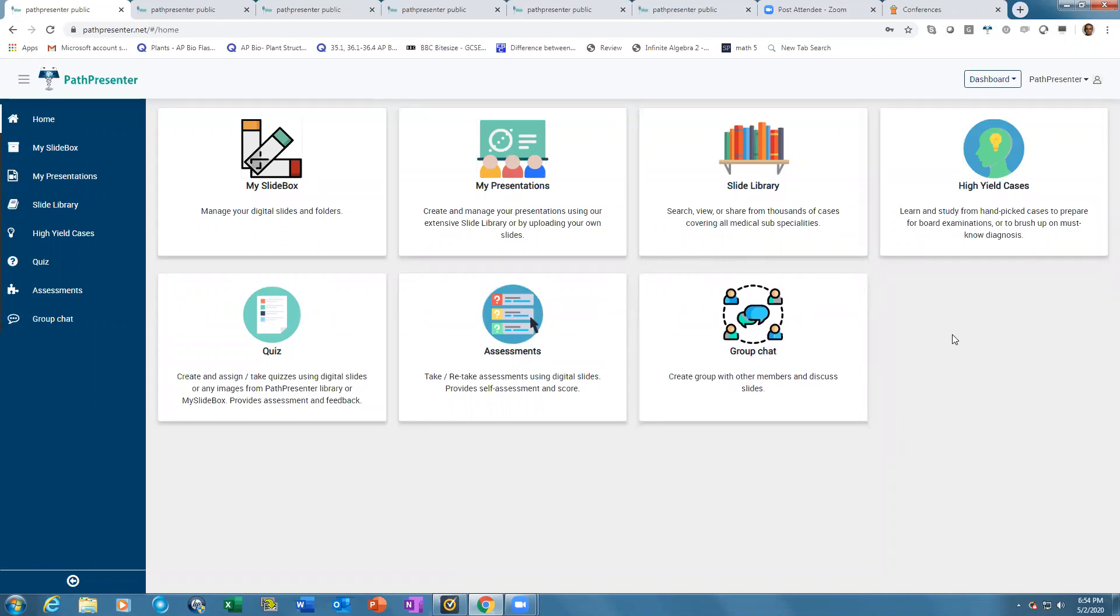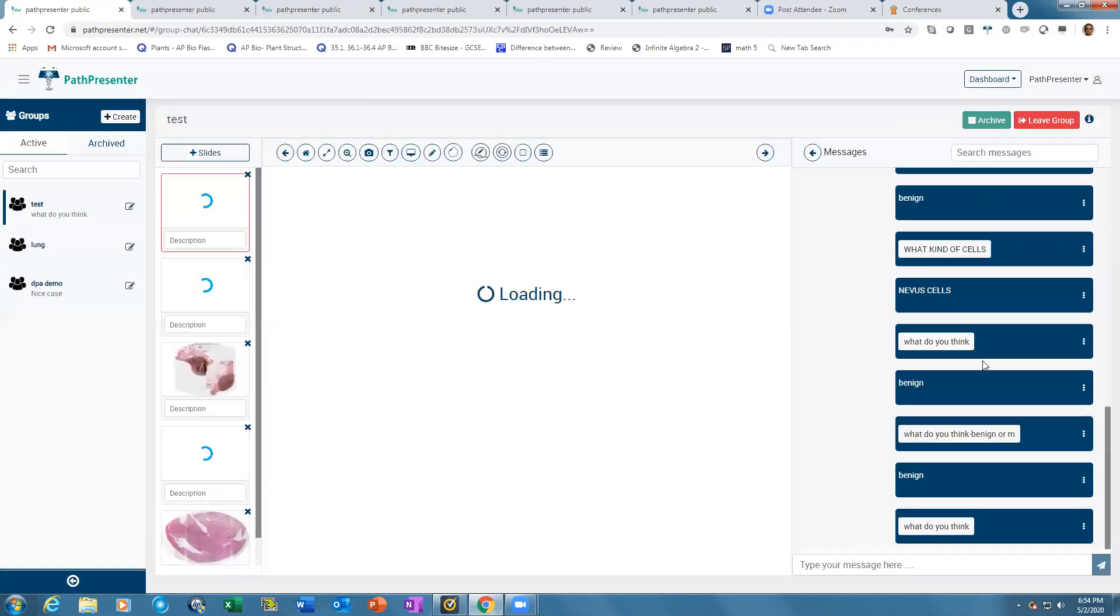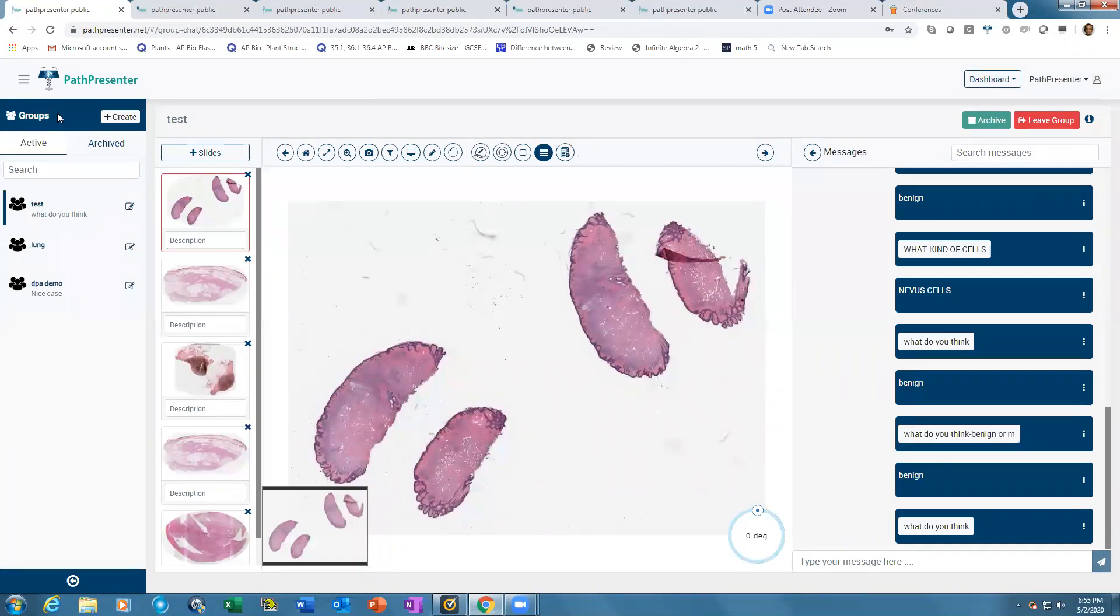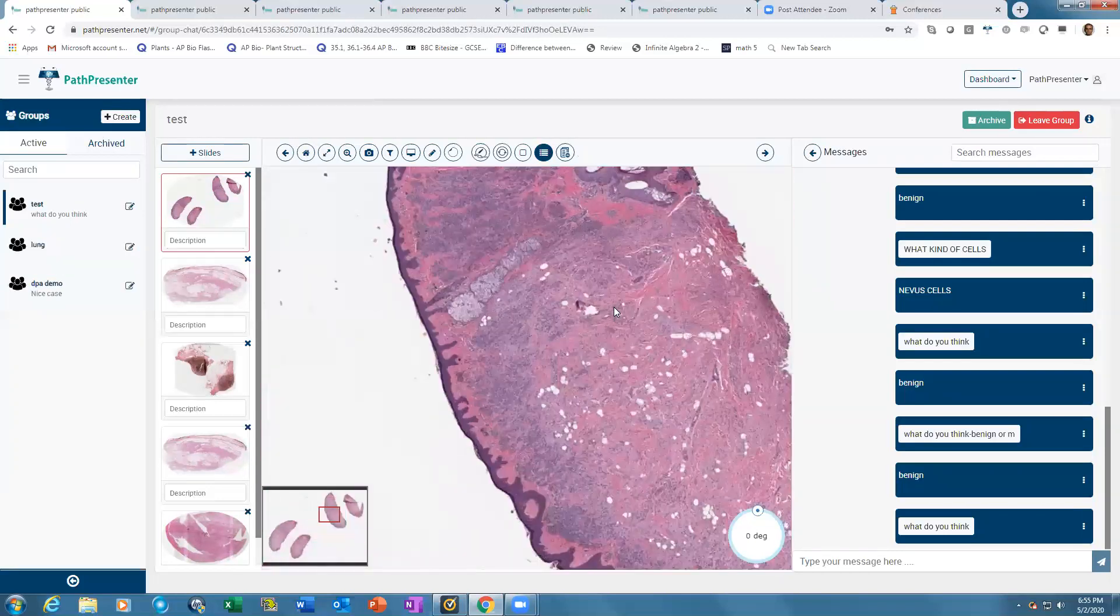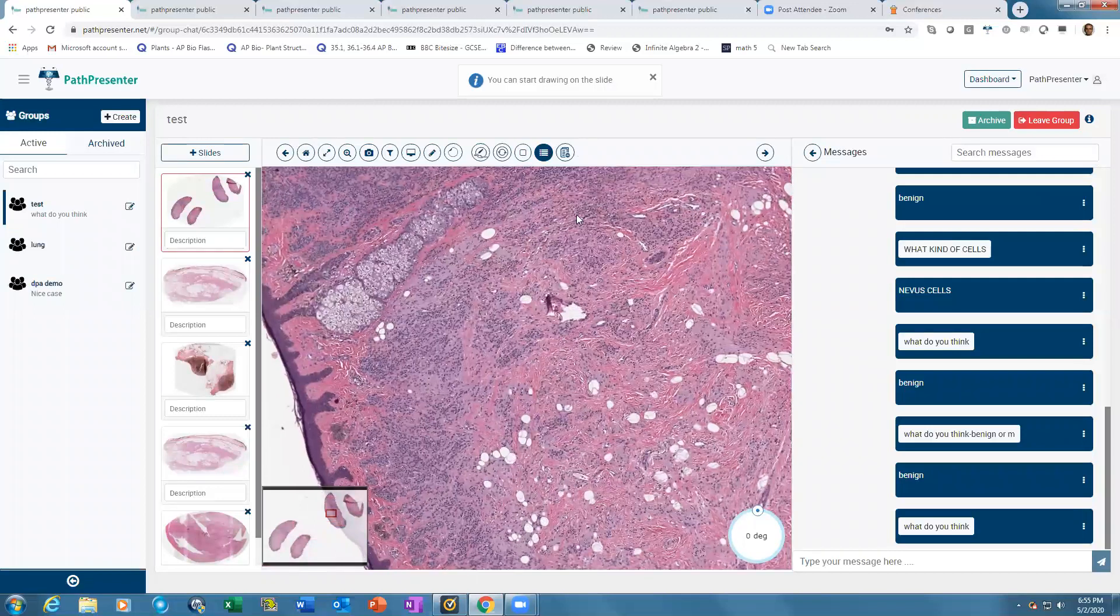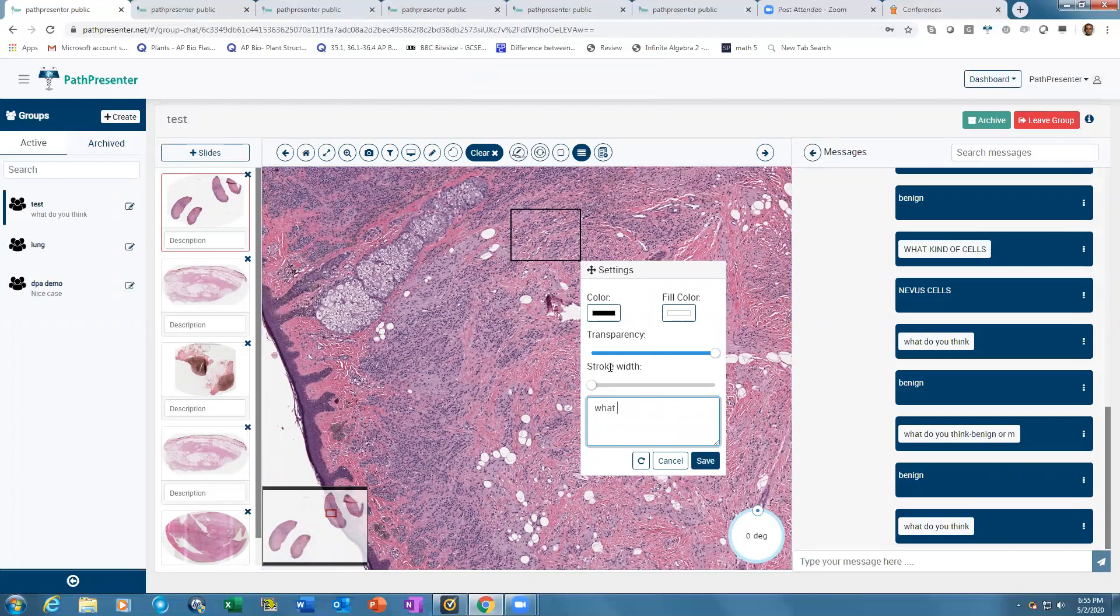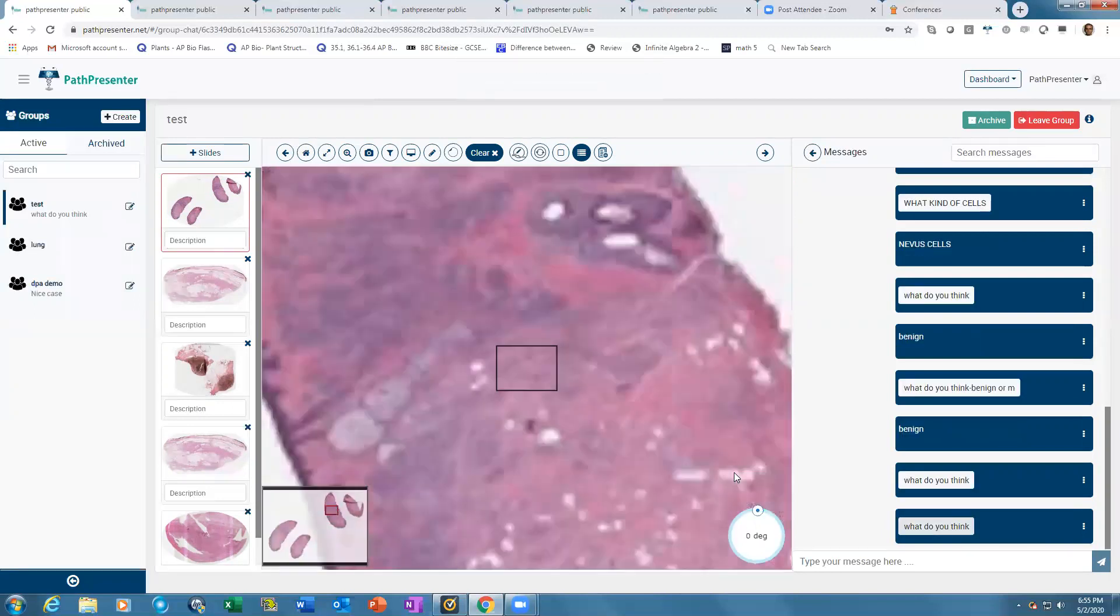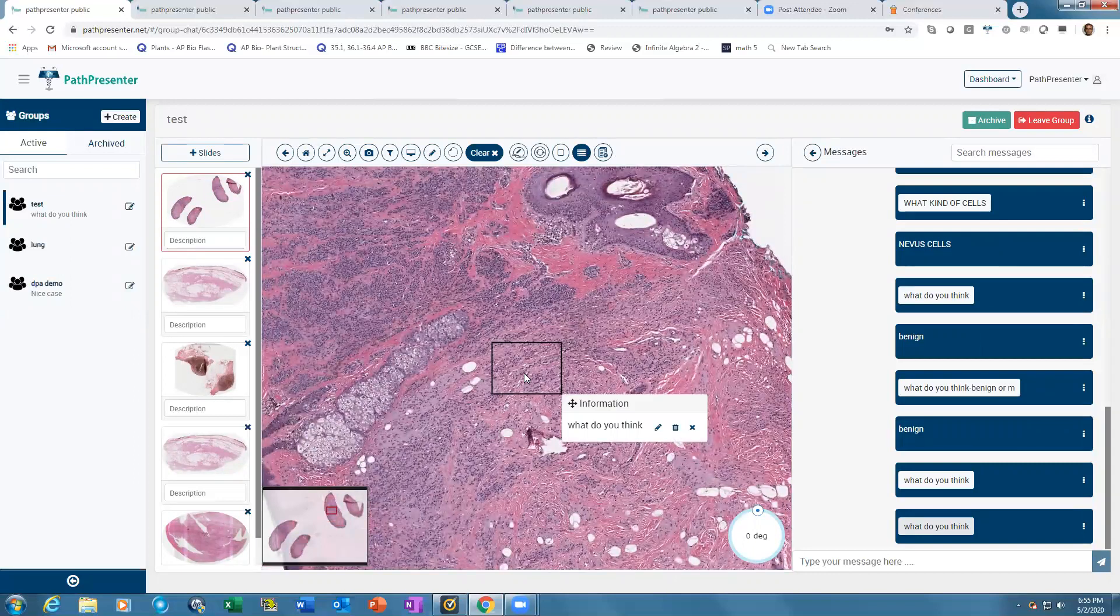The group chat allows live group discussions on the cloud with WhatsApp-like messaging for closed groups. First create a group, add your slides, then create annotations for areas where you want to ask questions. When you put in a question, the entire group gets a notification. When they log in and click the question, it zooms into the slide showing what you're asking, and they can answer in a WhatsApp-like chat.